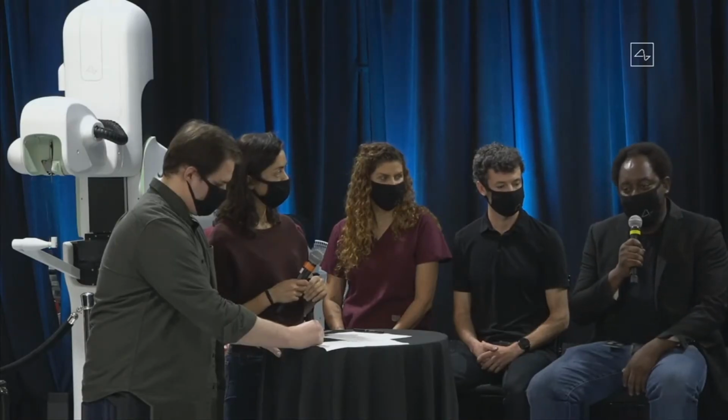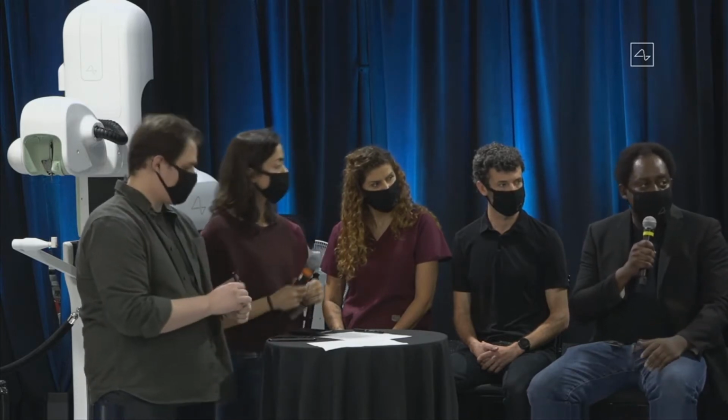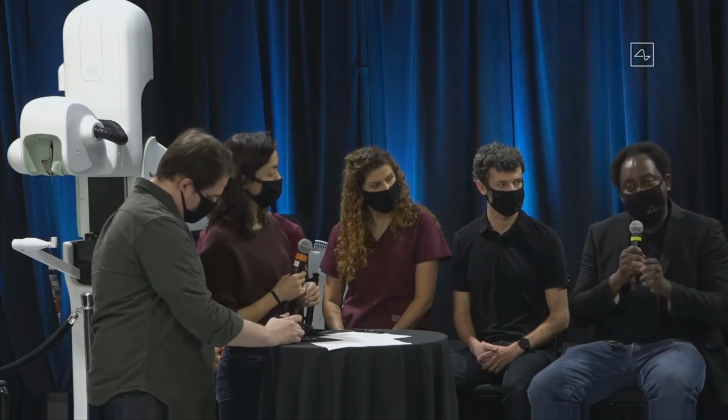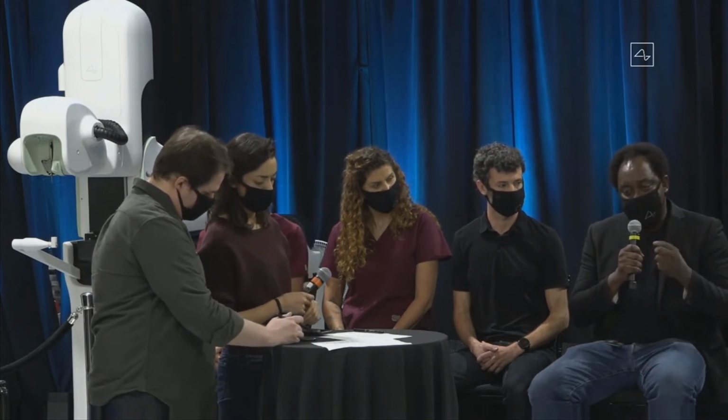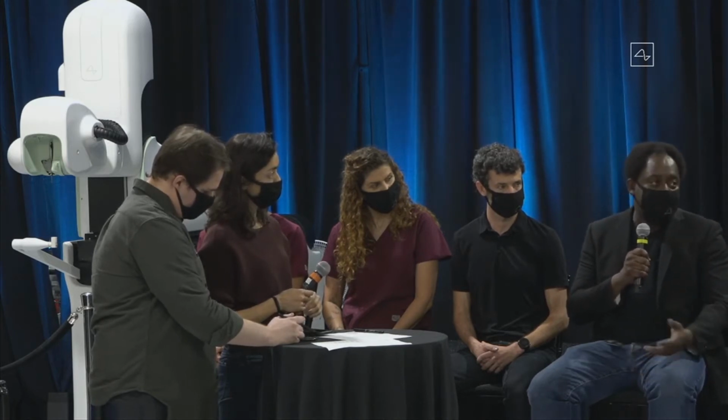and it has to stay that amount of insulation over time. So this is why we think probably a silicon carbide type insulator is probably the best long term from a material science standpoint. But silicon carbide is a tough material to work with, but that's probably the right choice long term. Would you say? Yeah, I totally agree. And apart from its electrical properties, it also helps with adhesion between the metal layers and the polymer substrate. Another thing that we're also looking at is, since we're reducing the electrode dimensions, the actual side that speaks to the neuron also has what we call high resistance to the signal.